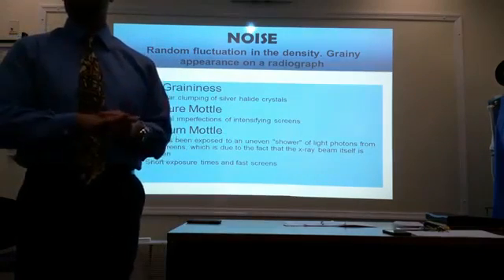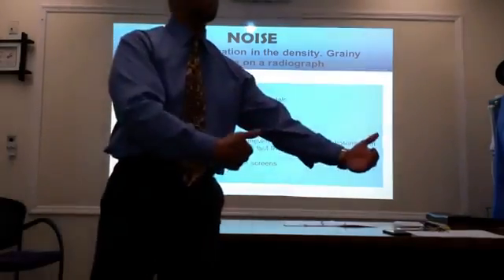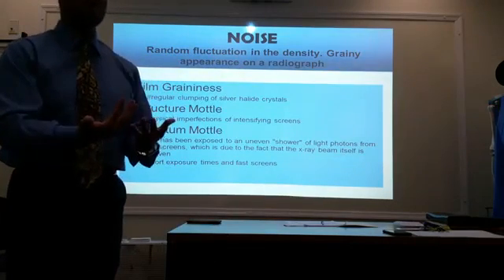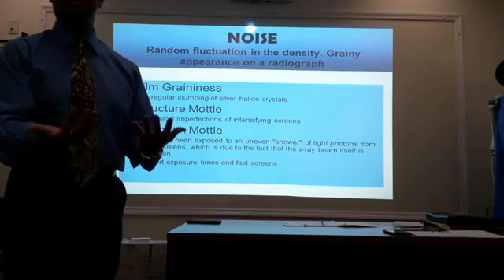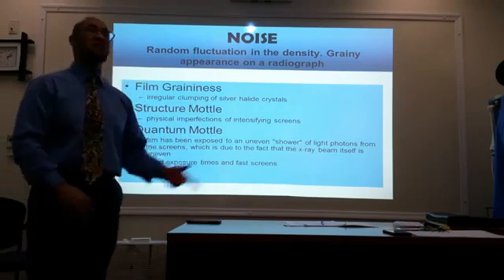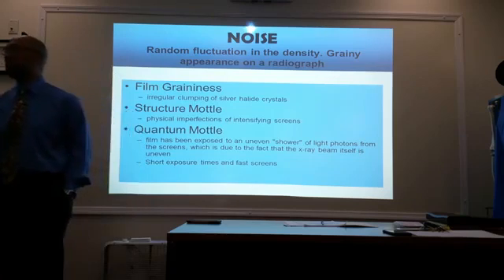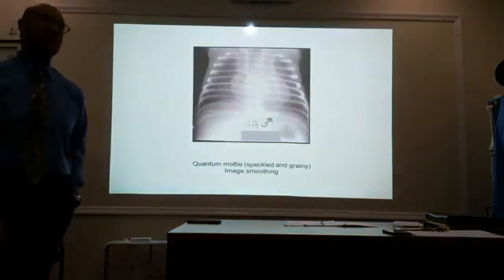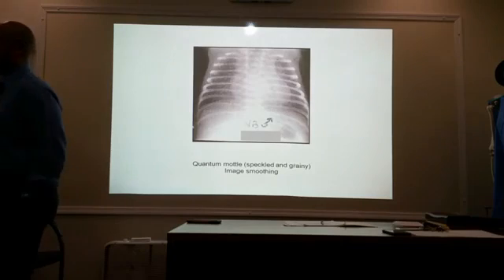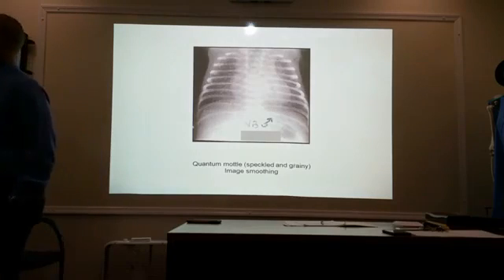Okay? So that slab is going to be dotted. Short exposure time. If it rained for a longer period of time, that slab of concrete is now going to be completely wet. Completely wet, more density, less spottiness. Okay? So the showering effect happens with shorter exposure times, where you're going to result in an image that looks spotty and grainy. That's quantum mottling. Quantum mottling. Okay, any questions?